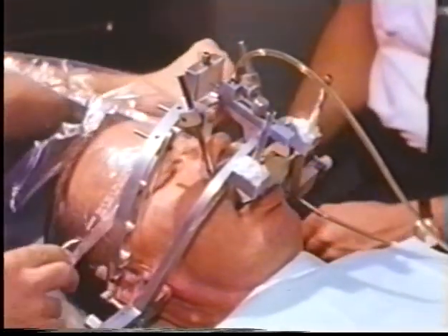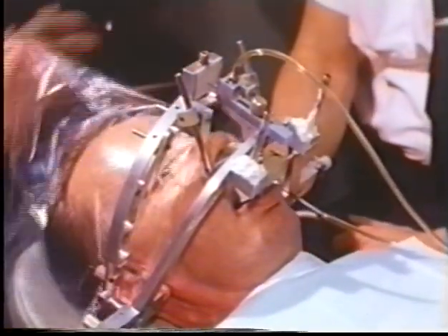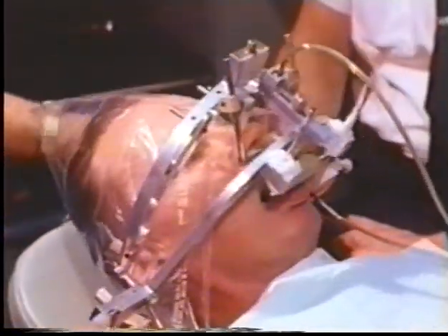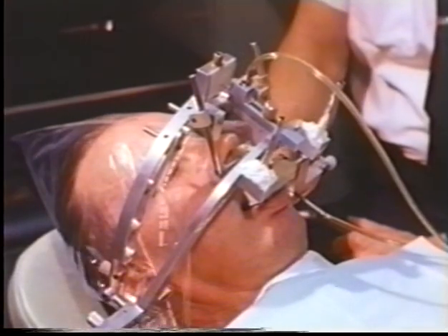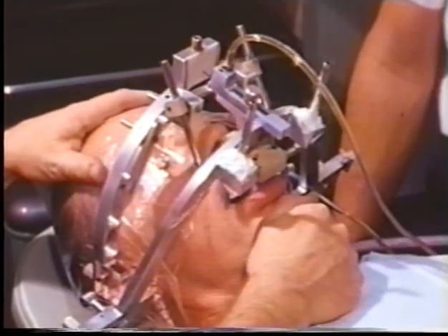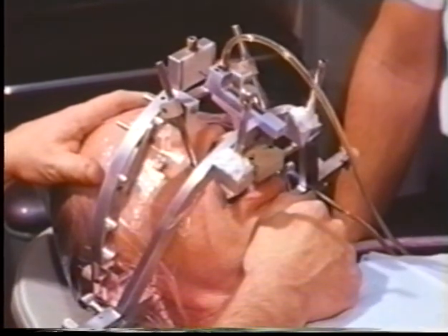A clear plastic shield is placed over the patient's face to protect him from the resin particles generated by the drills. The subject is rehearsed in the various movements to be recorded.